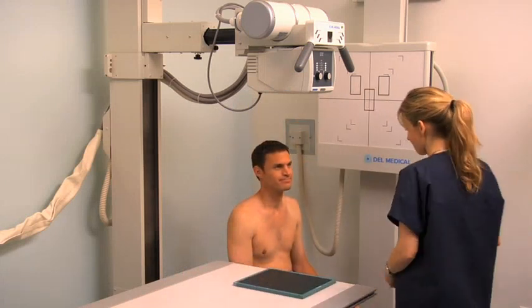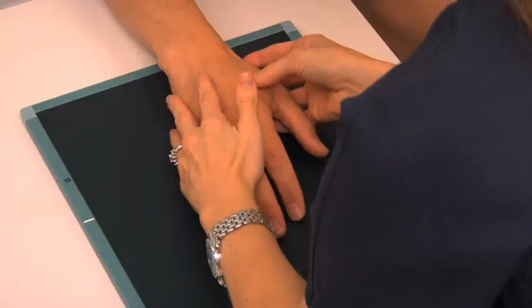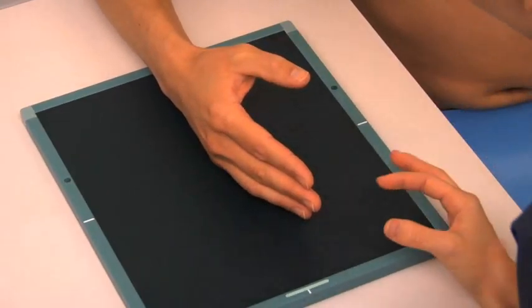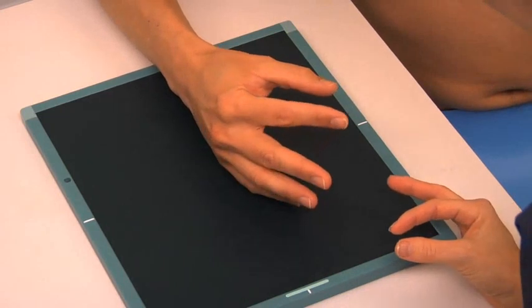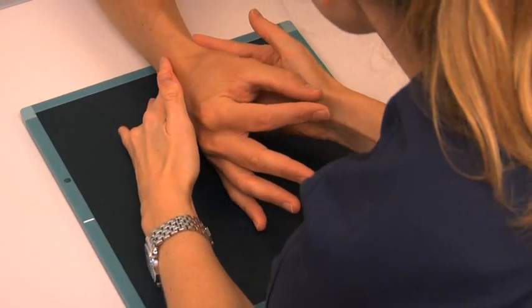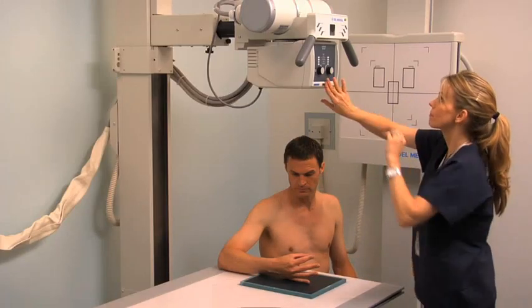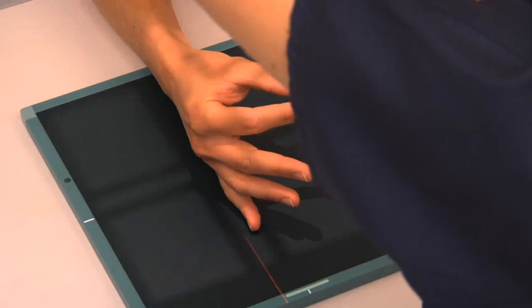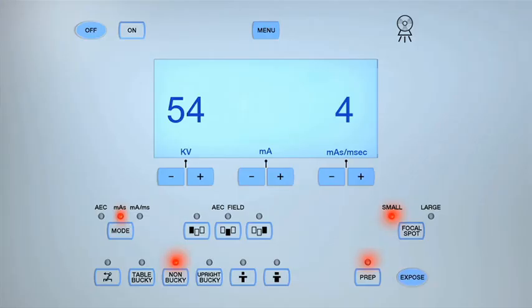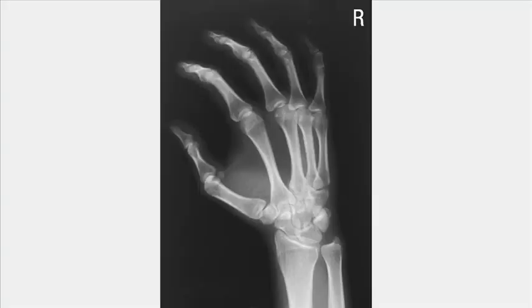With a new cassette in place, obtain a fan lateral projection of the hand. Rotate the hand and forearm laterally until the hand is in the true lateral position, with the ulnar aspect of the hand remaining in contact with the cassette. Assist the patient to separate their fingers in a fan shape. Center the central ray to the second MCP joint. Collimate the light field to the appropriate anatomy, then expose and process the cassette. Review the images of the three projections.